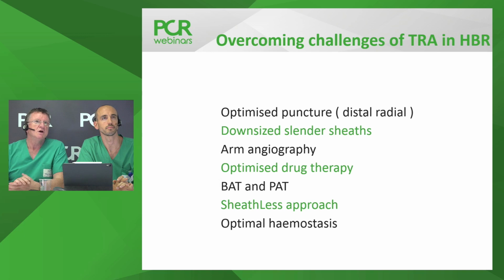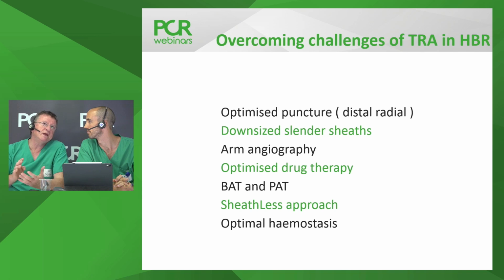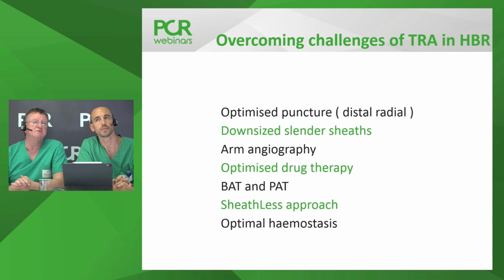Optimized drug therapy, I don't know how you feel about that. I routinely give a vasodilator cocktail at the beginning with some verapamil and GTN. We use isoptin. For everybody. For everybody. Yeah, okay. So, some operators will defer using that unless there's a problem with spasm or some difficulty with manipulating equipment. But I recommend using a vasodilator cocktail at the beginning for everyone to minimize the risk of spasm.